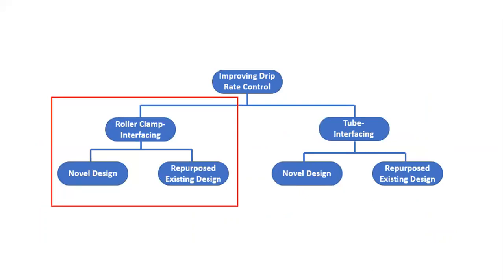During concept generation, I focused in on roller clamp interfacing solutions since these would give more insight into what exactly it is about roller clamps that make them fail in the way that they do. But I was open to doing this in a totally novel design or repurposing materials or currently existing solutions.